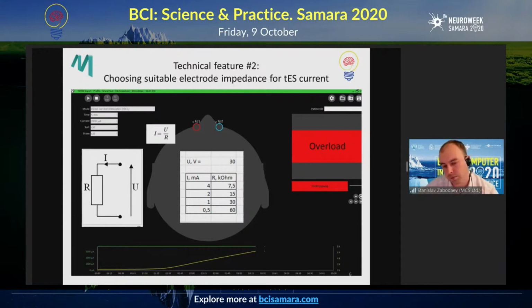It is quite easy to reach this value if you're using small surface area electrodes. Then you need to pre-treat the skin with abrasive scrubs. There are different market options available. Then you need to apply a conducting gel or paste, or you can use cotton sponges soaked in saline. This is the most common way to apply the electrodes, but I believe that gel is more beneficial.